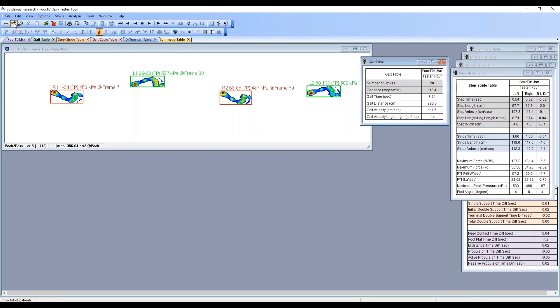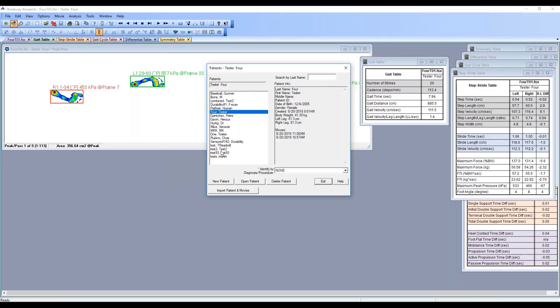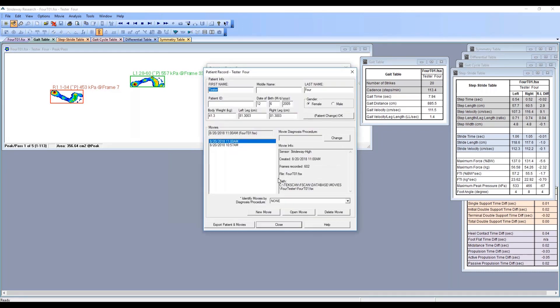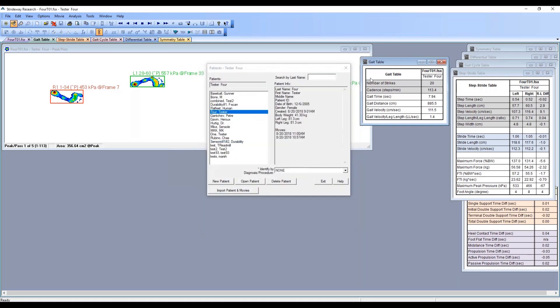You can go back into the patient database and add those measurements. You have your left leg and right leg measurements along with the body weight. If you fill these boxes in with the measurements and then hit okay, you will get a value in this box. If you did not fill that in, you'll get an NA here.